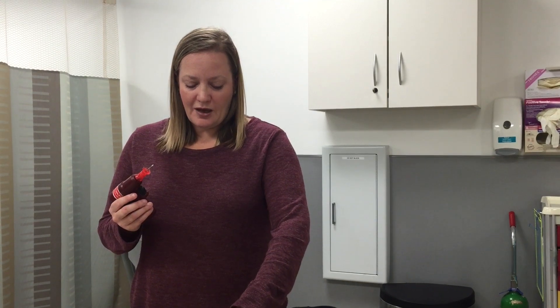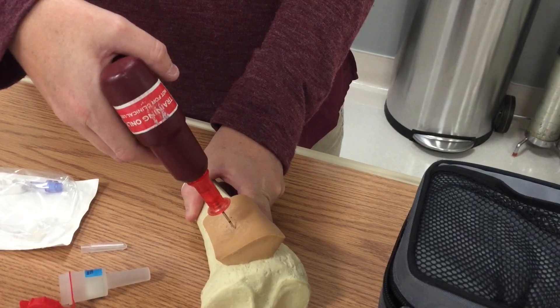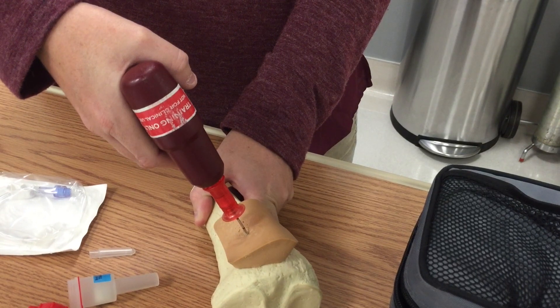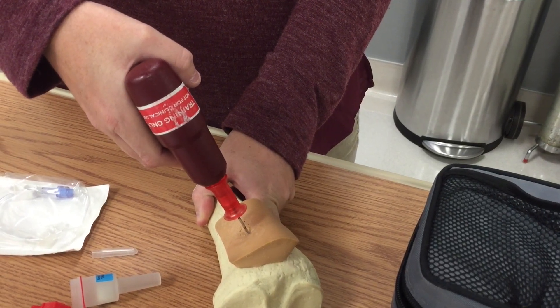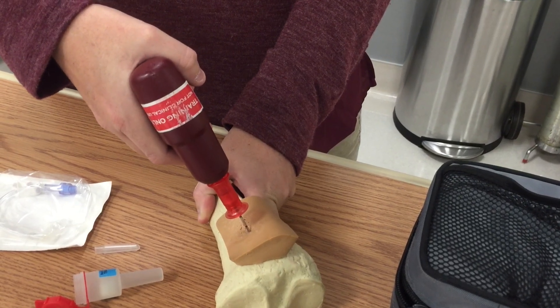Prior to inserting the IO, you will use betadine or alcohol over the skin. In this model, make sure you hold the bone fairly secure. You're going to place the IO drill and hold steady pressure with the drill on. As you advance the needle, you will feel a slight give, and that's how you'll know the needle is secure in the bone marrow.